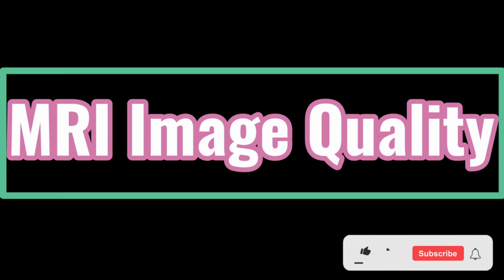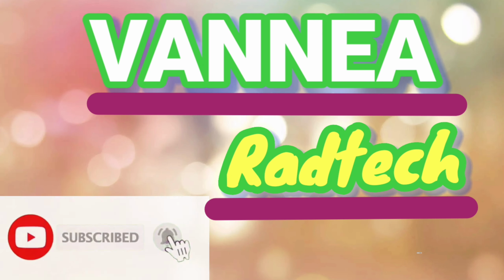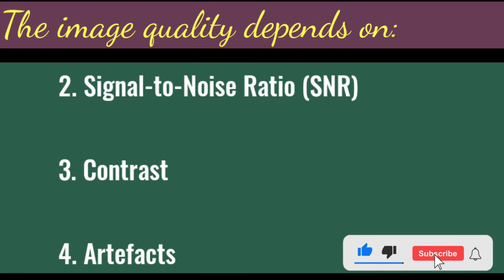MRI Image Quality. The image's quality depends on: 1. Resolution, matrix, field of view (FOV), slice thickness. 2. Signal to noise ratio. 3. Contrast. 4. Artifact.